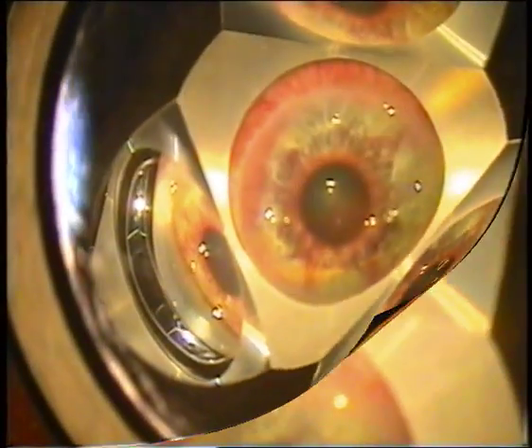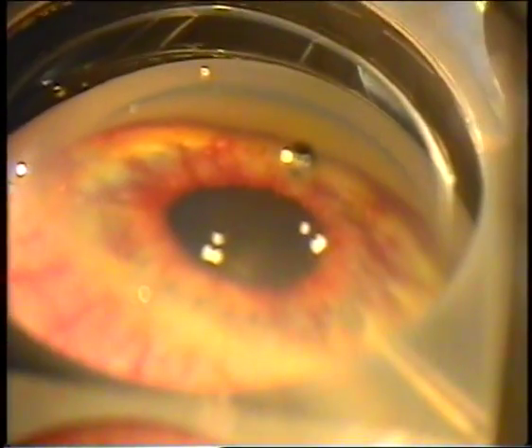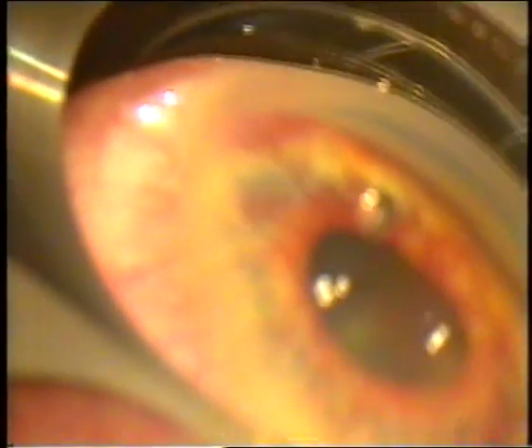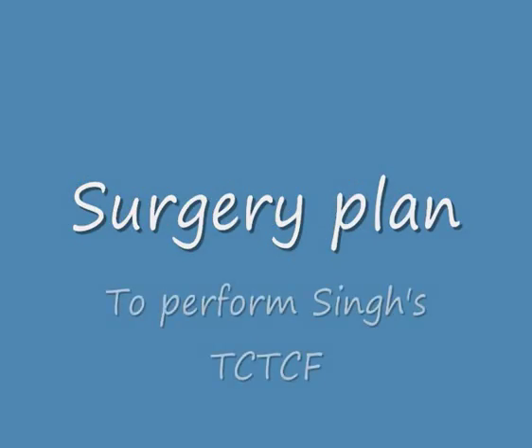Before operation we did gonioscopy using a three-mirror contact lens to observe the details of the anterior chamber angle. We observed that in the angle there are a lot of new blood vessels. In such cases, any glaucoma surgery entering the anterior chamber and dealing with the iris will lead to a significant amount of hemorrhage.